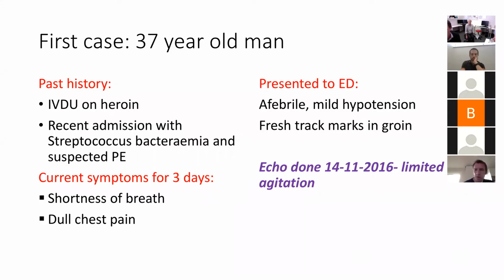Sorry, can I ask one quick question? Yeah, sure. Hi. I'm still sometimes a little bit confused about the inflow, because everyone I speak to has quite different opinions about the utility of it, number one, and two as well, the numbers. Yep. I just quickly looked up the ASE document again, and for the tricuspid they say greater than 60%. So yeah, the numbers are all over the place. I also read the 25 number. Maybe I could also say that in my experience, the mitral and tricuspid inflow has never dramatically changed the way I'm going to want to manage that patient.